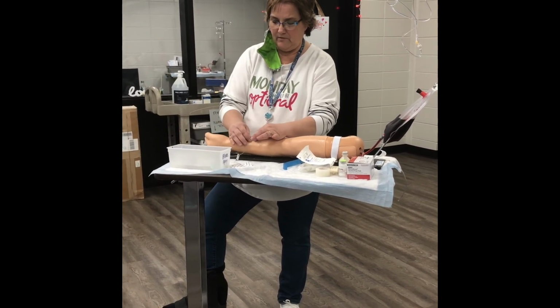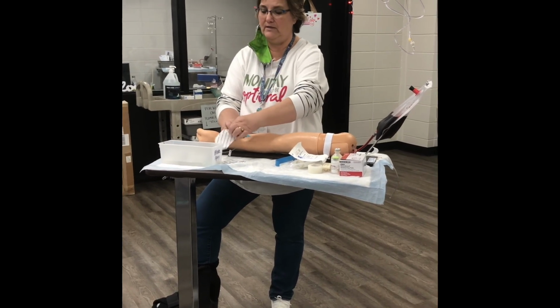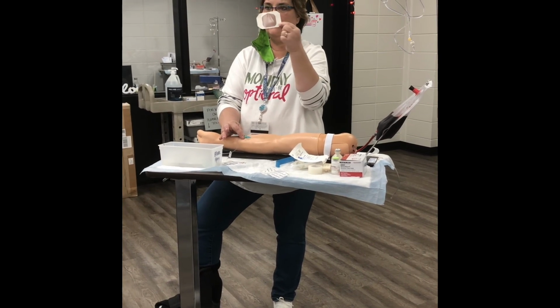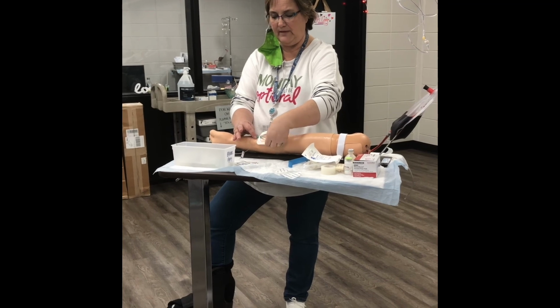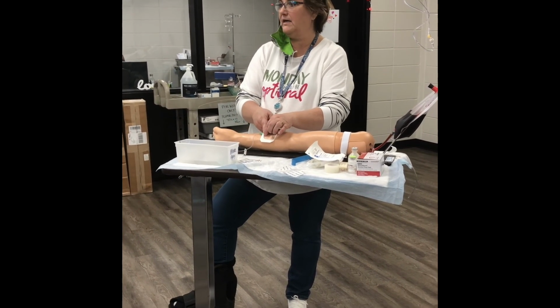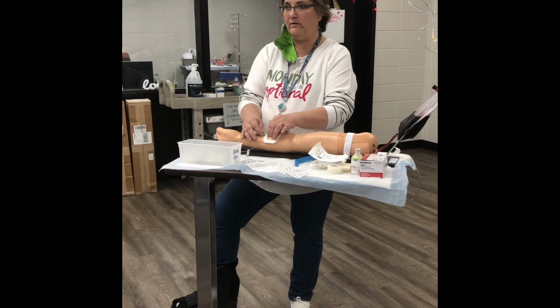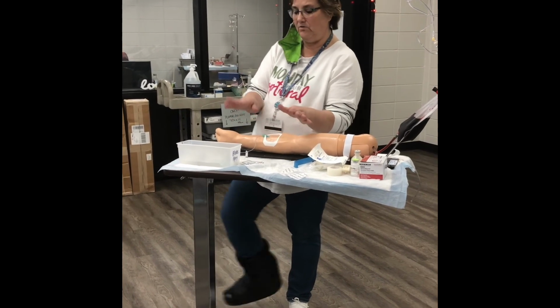So I'm going to change hands. You have your little handle there, pull it off. That part goes up to the top. You want to completely cover up the colored part of your catheter, but don't cover up where it connects. All right, so then pinch it together around your catheter and then put your hand down on the rest of it. And once that's on, you can let it go.